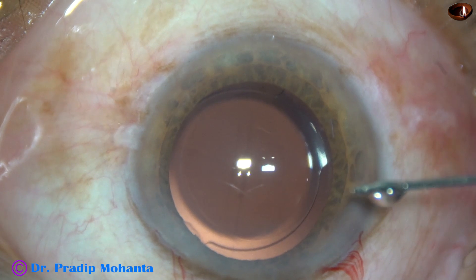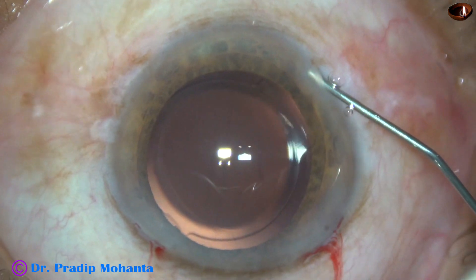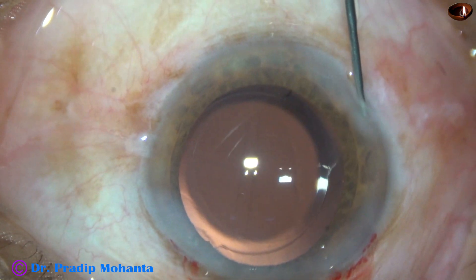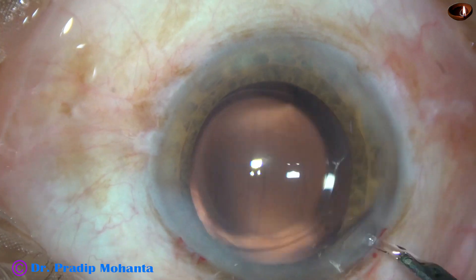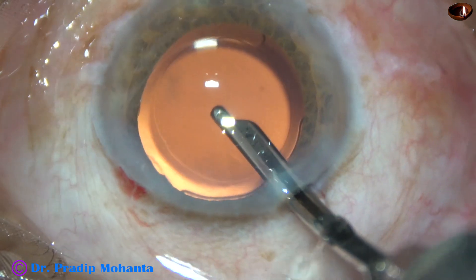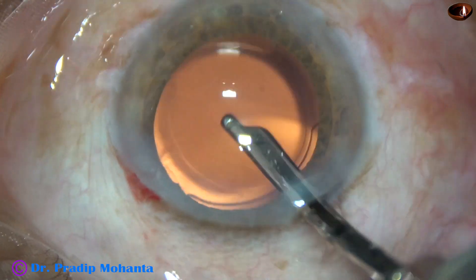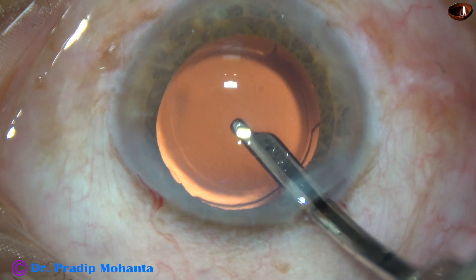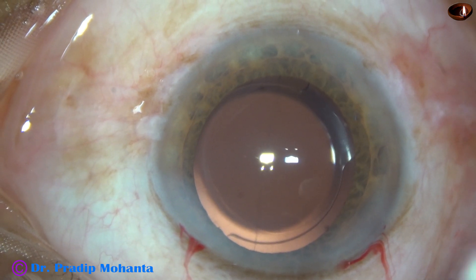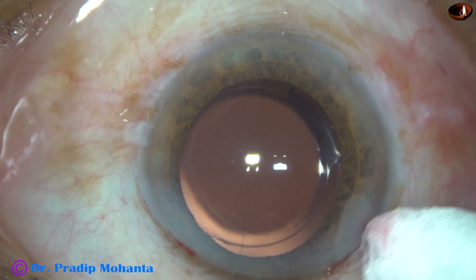And now this is a bit of moxifloxacin. The side ports are closed by hydrating corneal stroma with BSS. The case is almost done. A final lavage of the anterior chamber is done. You can notice that the main wound doesn't require any hydration for its sealing. I use the Simcoe to form the anterior chamber, then check the integrity of all the wounds using a cotton-tipped applicator, and apply a few drops of moxifloxacin over the ocular surface to conclude the case.